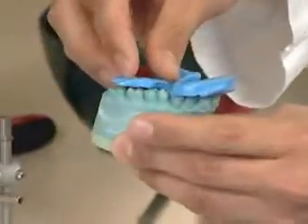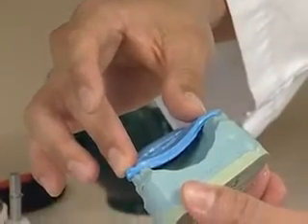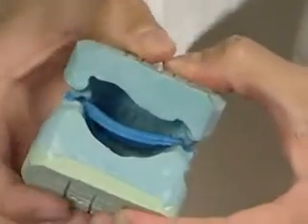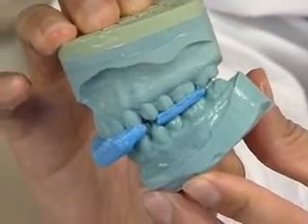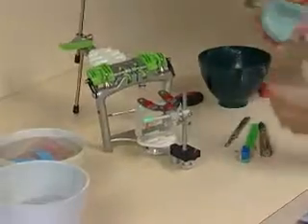So I would trim a little bit off of the lingual here and here to make sure that it's clear. And now you'll put the upper bite on and do the same thing. Look from the lingual, make sure it's not touching the soft tissue anywhere. There's no problem from the lower, but we should check to make sure it fits on the lower good. Our models fit good into our wax bites, so we can proceed now. Once the support stone on the upper bite fork is set, we can proceed to mount our upper model.